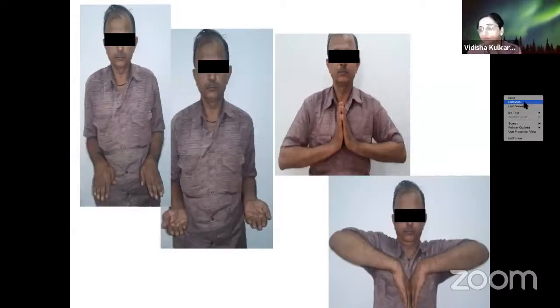Has the lateral had any influence on your choice of treatments? In our area, I have to think about economics. Since it was a more dorsal comminution, I went dorsally. It's easier to reduce the dorsal wall and fragments through a dorsal approach because of the hematoma. Abhijit, your comments on that, and also whether the fracture being bilateral may play a role in the choice of implants.